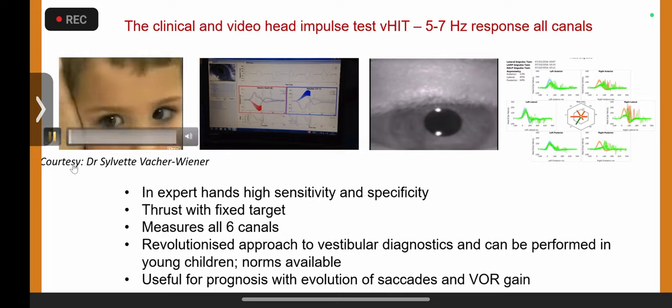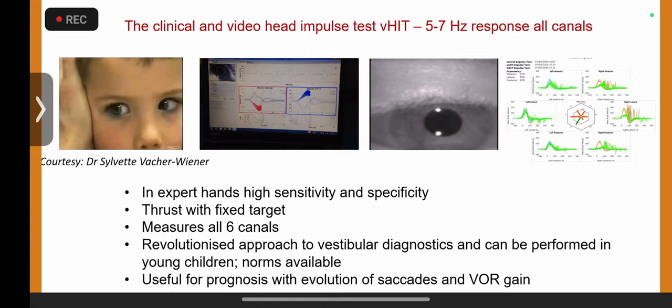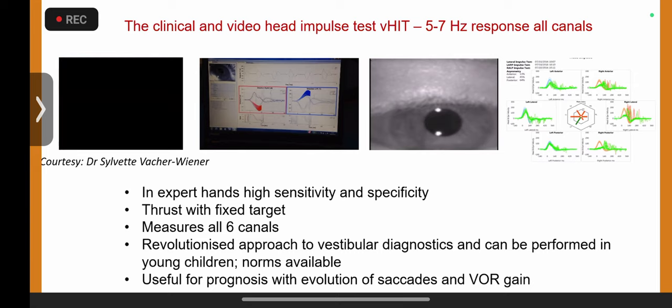This is a child, taken from Professor Wiener's collection. Watch carefully for the saccade. There we go — beautiful saccade on the right and the left, so bilateral vestibular dysfunction in bilateral sensorineural hearing loss. This was one of the videos borrowed from Silvet that set me on a career in vestibular medicine.